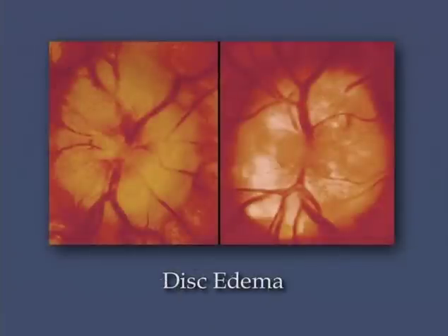Signs of pathology include optic nerve head blurring or elevation, pallor, a pale white appearance of the disc, or blood on or around the optic disc. Any question of an abnormality should be referred to an ophthalmologist. After you have finished looking at the disc, examine the vessels from the disc outward to their second bifurcation. The arteries are approximately 4/5 the size of the veins. The arteries also have a slightly redder appearance and may even have an increased light reflex.